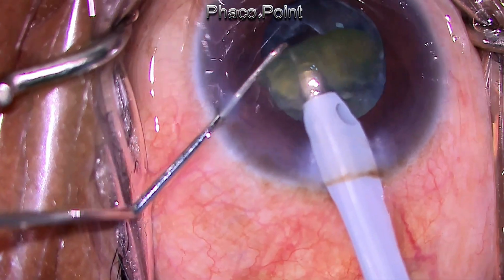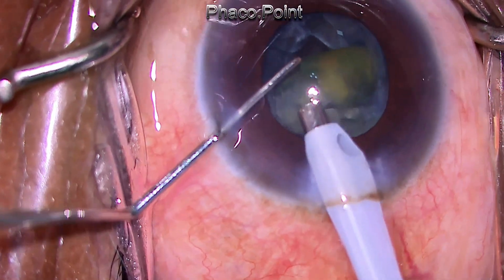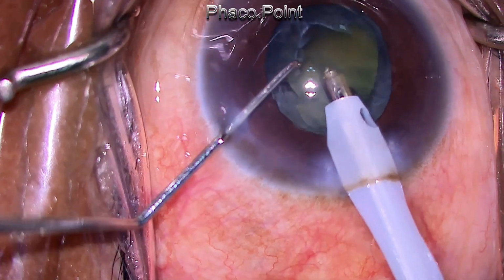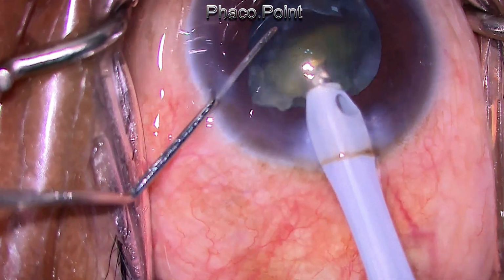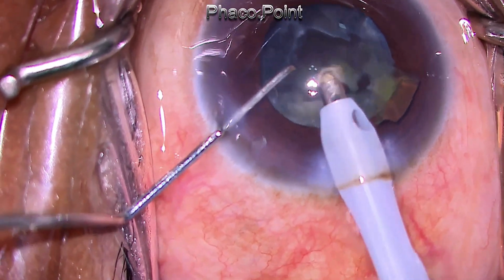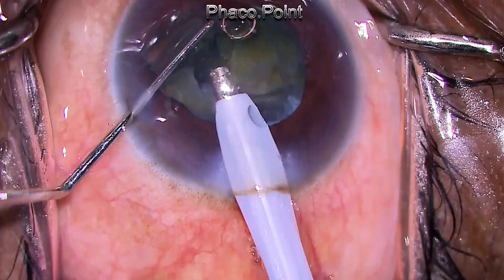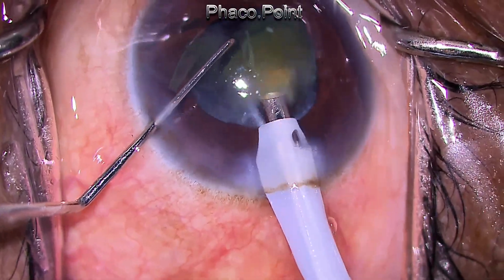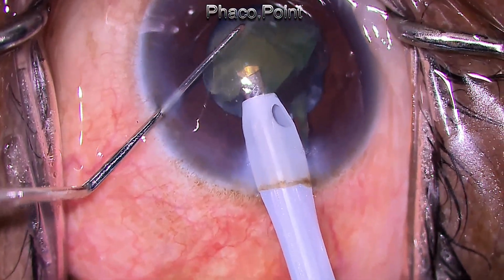However, you can clearly see that while performing the fragment removal in this case, the surgeon is holding the piece in the central zone. The bevel is clearly exposed, which means that she is holding the phaco tip in a horizontal position. This automatically means that she is close to the endothelium, and because the nucleus fragments will lollipop onto the surface of the phaco tip, the nucleus fragments are also brought very close to the endothelium. The breakaway fragments can hit against the endothelium, as well as the emulsification or cavitational power, which is probably the reason why the patient had striate keratopathy.